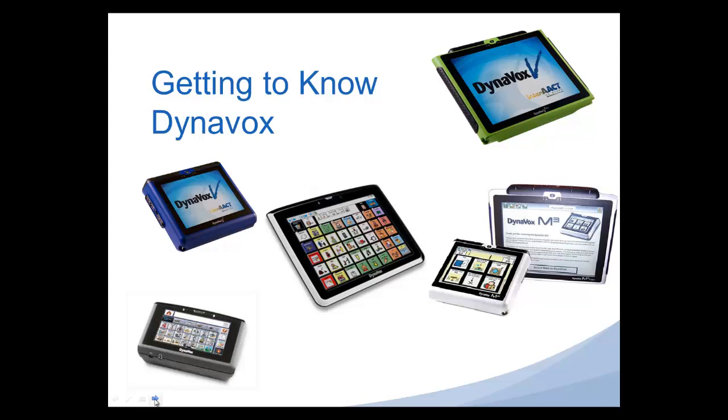Okay, so this is the range of Dynavox devices that are currently available on the market at the time of recording. Dynavox is essentially a brand of communication devices, and within their brand there are a number of different models available. This blue device here is the Dynavox V. You've got the larger version called the Dynavox V Max, the Dynavox Maestro, a small portable version called the Dynavox Express, and a simpler version of the Dynavox range, the Dynavox M3 and M3 Max.